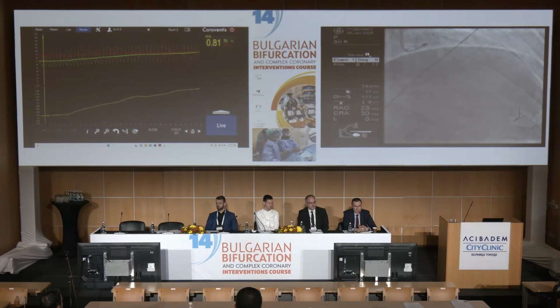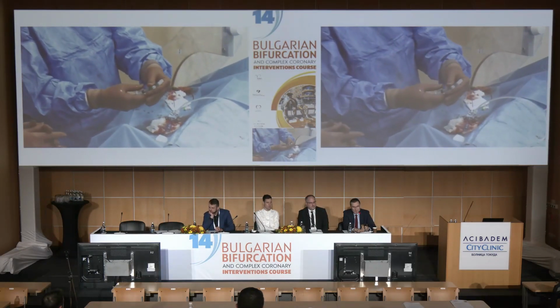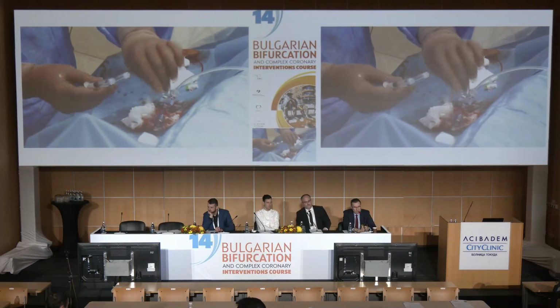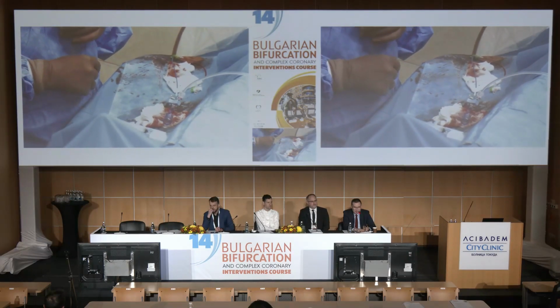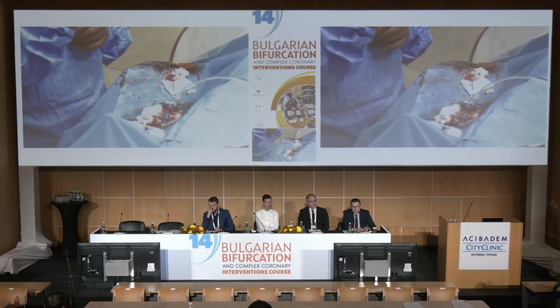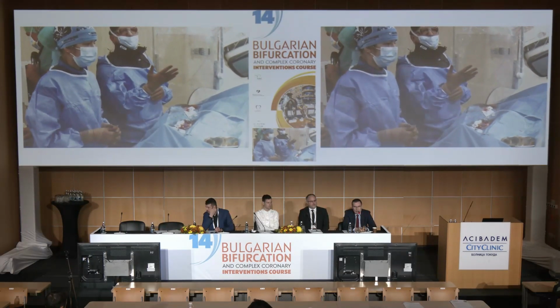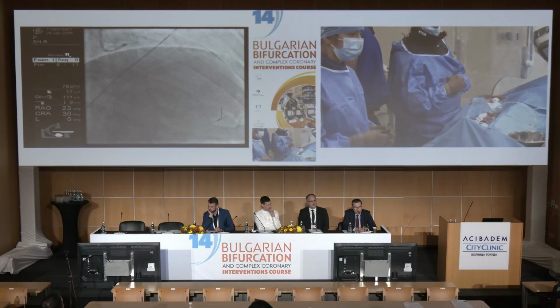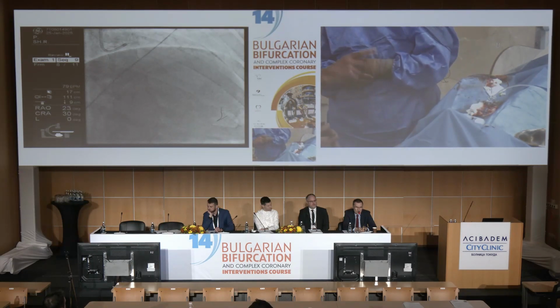What might be interesting, Frédéric and Adriaan and Dobrin, is to make a poll in the audience to see to what extent people are used to bolus thermodilution. Valérie shows that it is sometimes not so easy to do bolus thermodilution because it should be flushed very fast, and with the same saline you cannot use in this case the assistive device for the flushing.